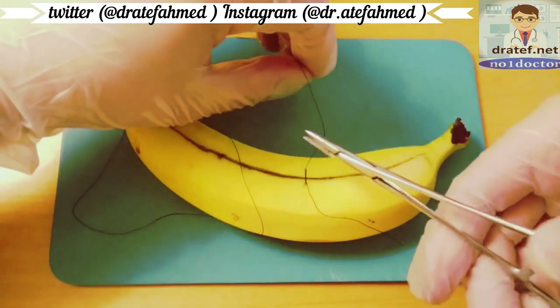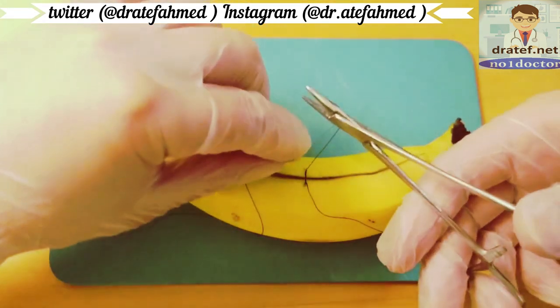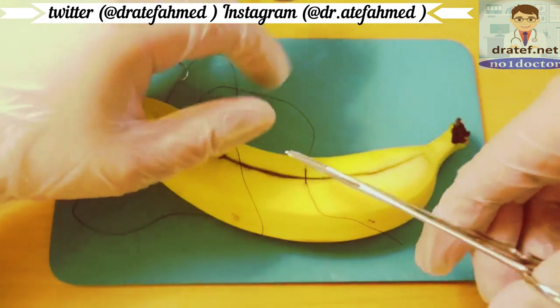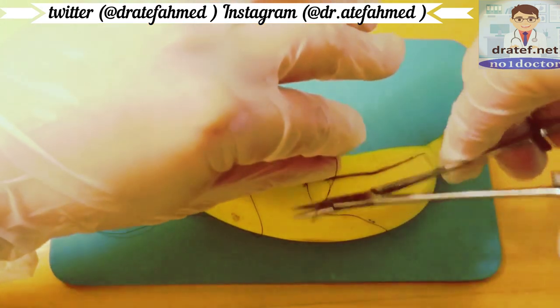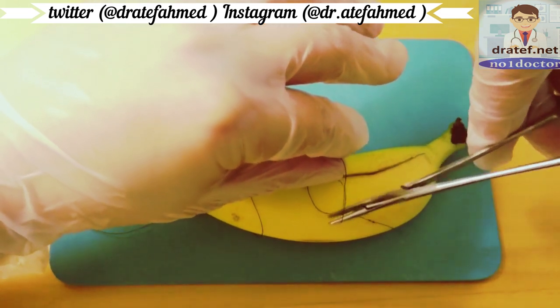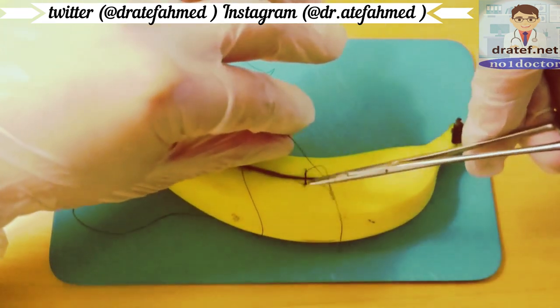Then we do the second throw. Start on the back side of the driver and bring the other end through.